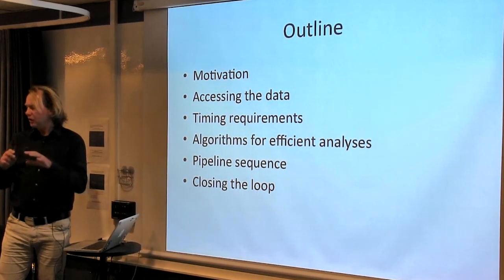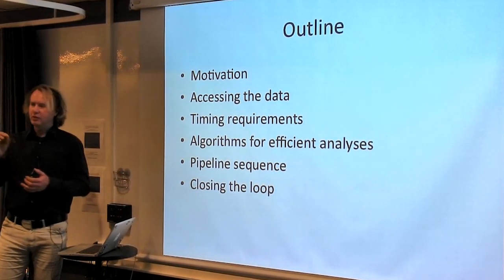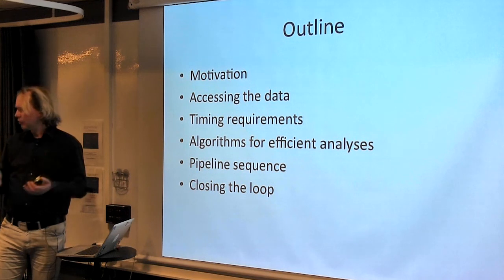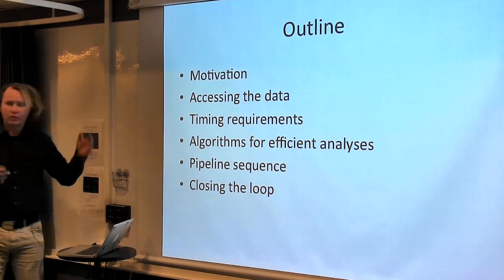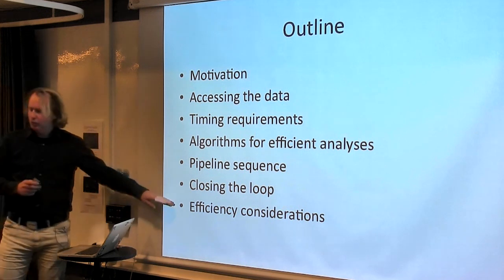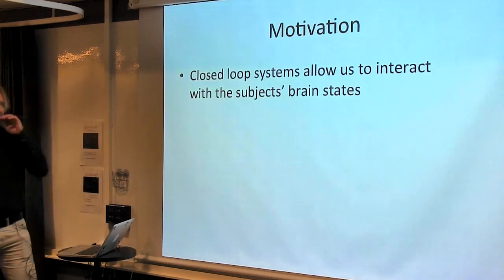And again, here it is important to consider, as with one of the previous presentations, if there's no reason to make the experiment more complex than needs be, then don't. So if you can run the analysis without real-time analysis, then run it without. But you can still do very fun things in real time, so that should not stop you from doing it in real time. And then at the end I have some recommendations with regards to overall efficiency of such a project. So the motivation.